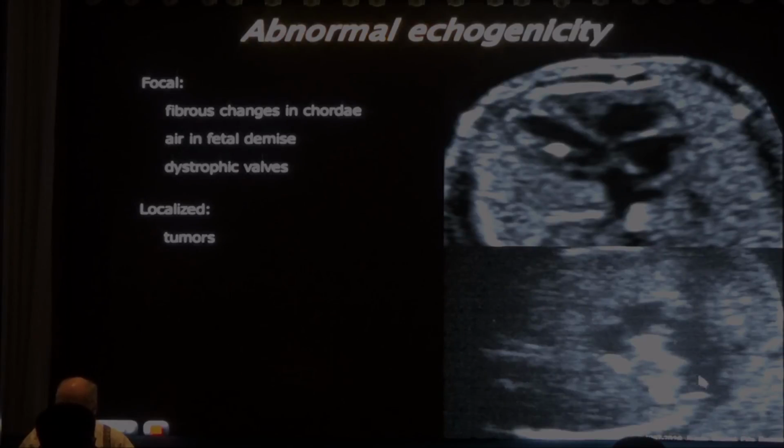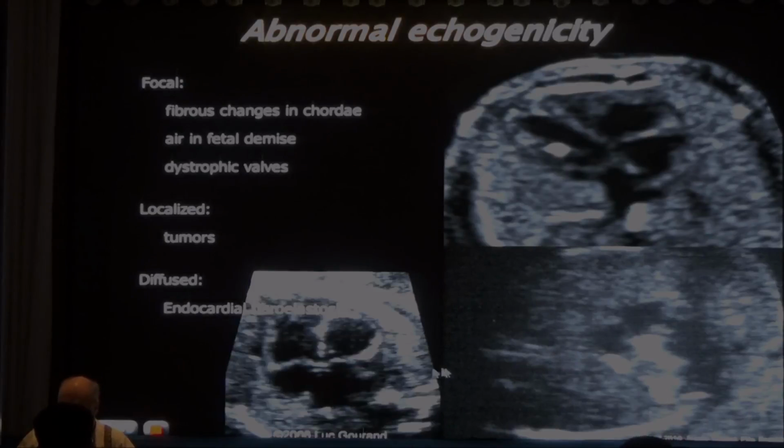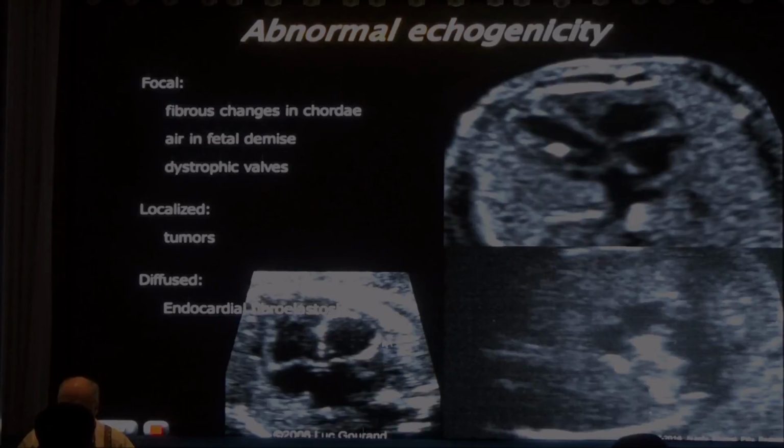This is a fibroma of the heart. This is a rare tumor of the heart, but it will prevent the heart from developing, and this left ventricle is not going to be functioning. And then sometimes you find a baby has a white line all around the heart.